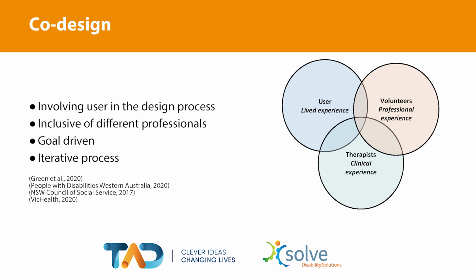That means there's lots of prototyping of parts for the user to trial, so we can constantly evaluate what's working and so we can make adjustments for it to work in the best way. This creates a dynamic where everyone can learn from each other and come up with the best solution for the user to be happy, achieve their goal, but also be empowered through the process. Now, we'll talk about how we've done this through some case studies.